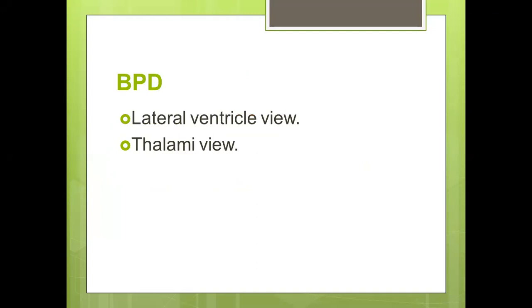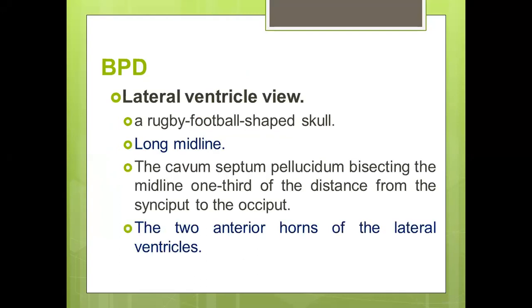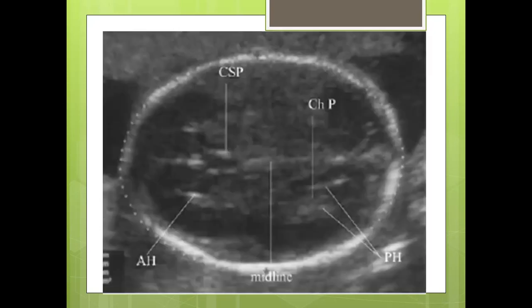First, biparietal diameter. We can measure biparietal diameter in two views: either the lateral ventricular view or the thalamic view. The lateral ventricular view should be in the shape of a rugby football — oval, not circular. There should be a long midline, not a short midline. The cavum septi pellucidi should be bisecting the midline at one third between anterior and posterior, and the two anterior horns of the lateral ventricles should be visible.